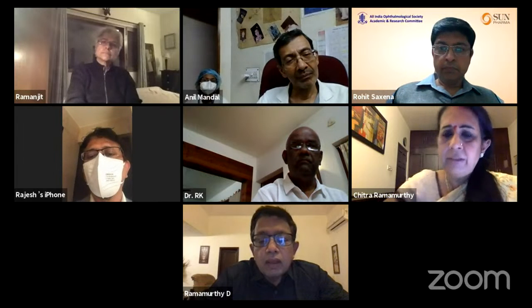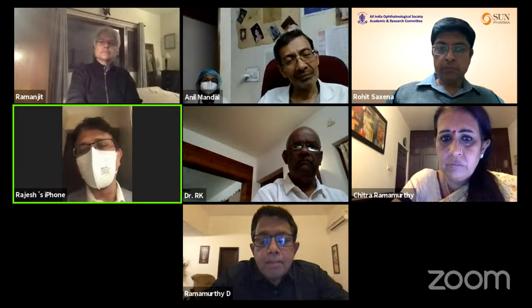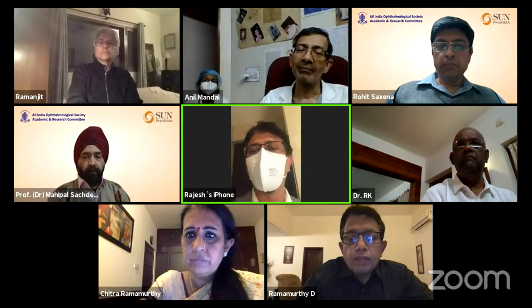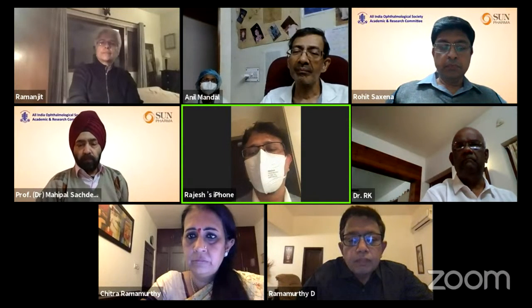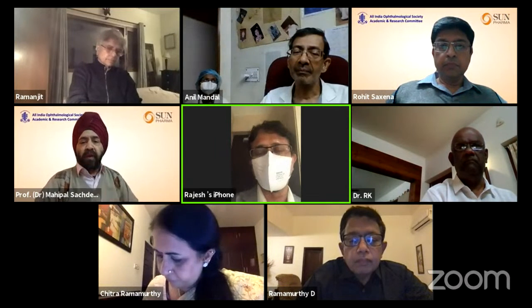Namrata, are you connected? Actually, the Aura also has a little bit of some element of error sometimes when you have not injected the viscoelastic properly in the anterior chamber. It's not tight. Then in that case also you do have some element of error. That is one thing I have felt.